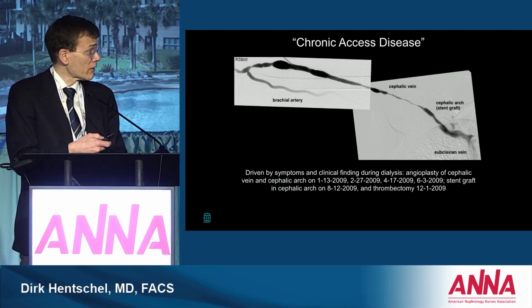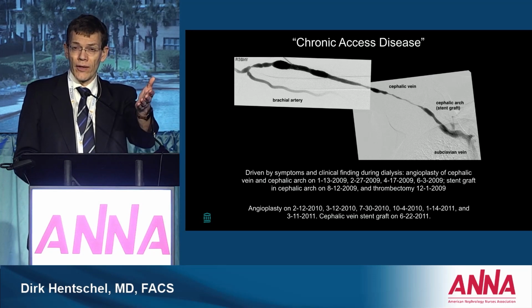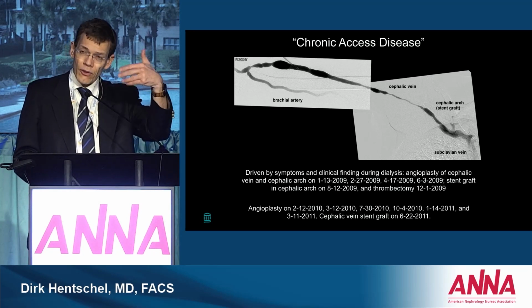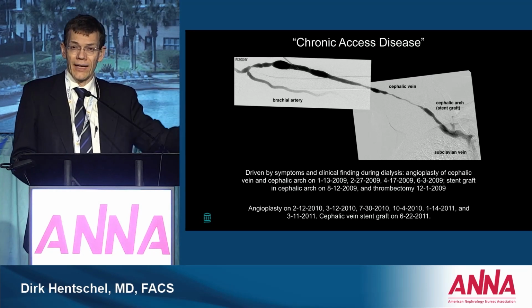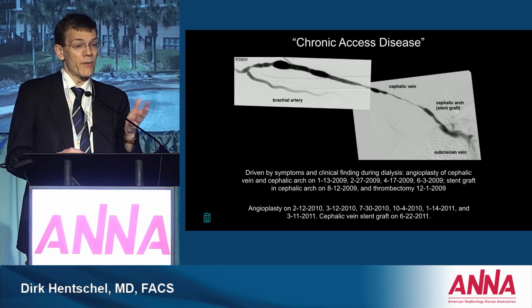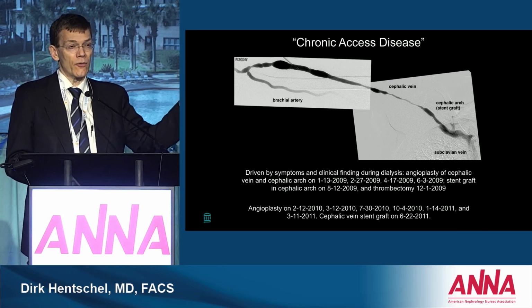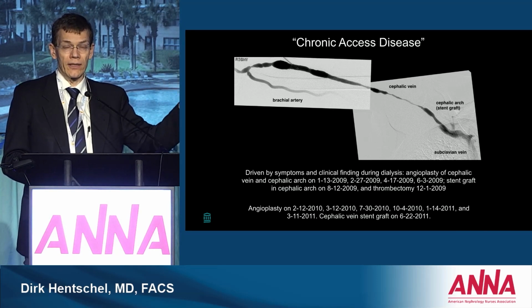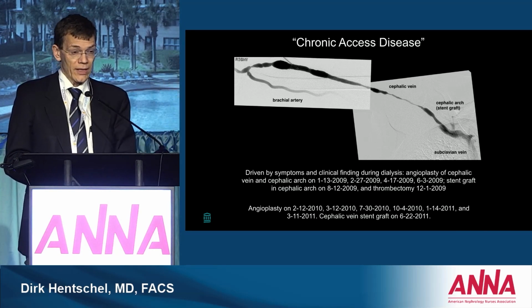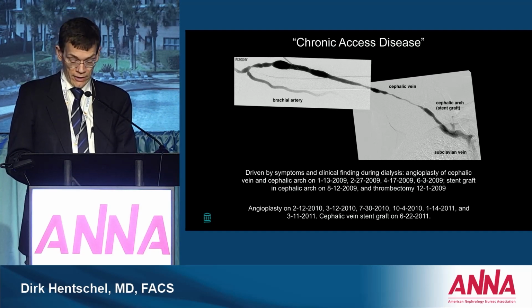And that's not uncommon. And with the use of stent grafts, you can often get a stable outflow there, and once the outflow is long-term patent, you often have fewer interventions that are needed to keep the access going. But interesting to see, the inflow stenosis we often keep, because even a small narrow stenosis like this will have flow volumes in the 1,000 range, which is plenty for dialysis.